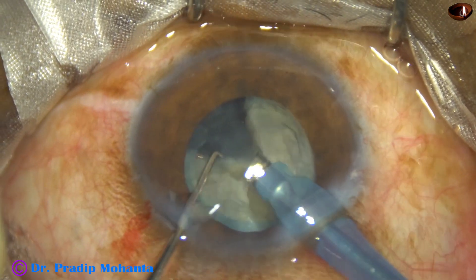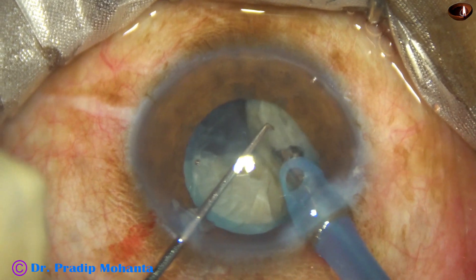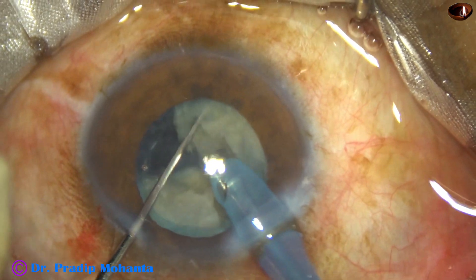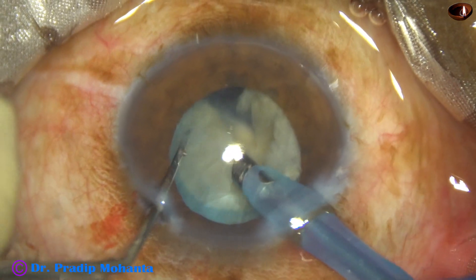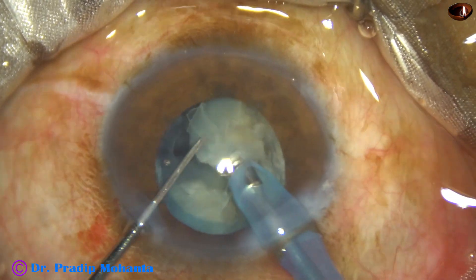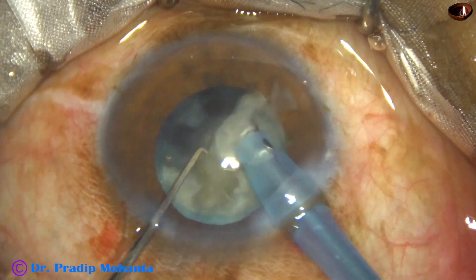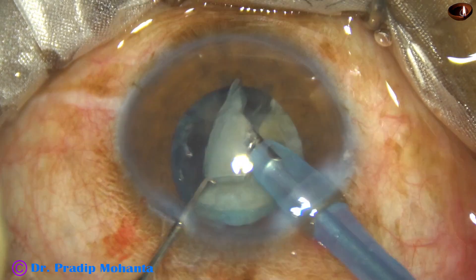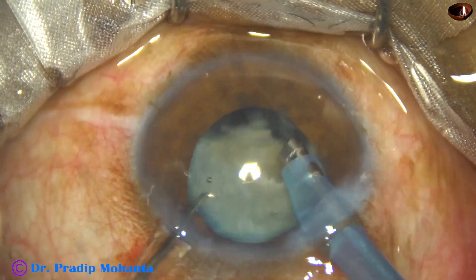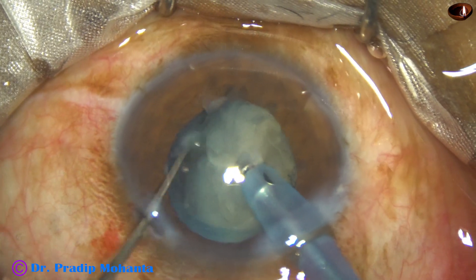This free nuclear fragment is emulsified. In this case, from the very beginning, the ultrasonic energy is 70%, flow rate is 45 cc per minute, and vacuum is 450 mmHg. So the nucleus is divided into pieces. The machine being used is the Oertli Cataracts 3. One hemi-nucleus is managed, and now the other hemi-nucleus is chopped into pieces.